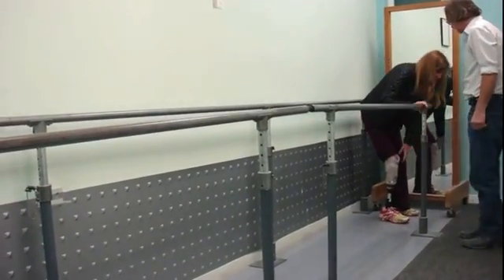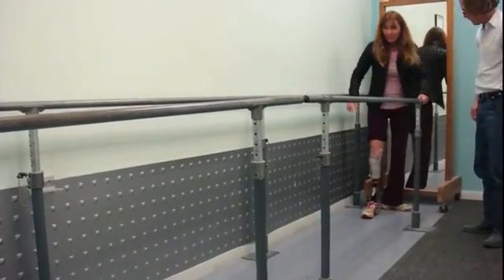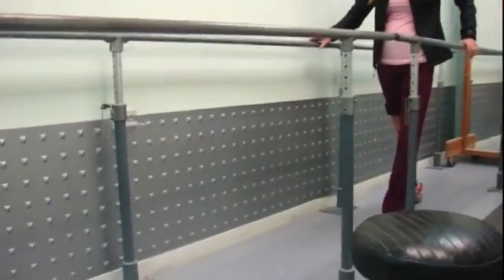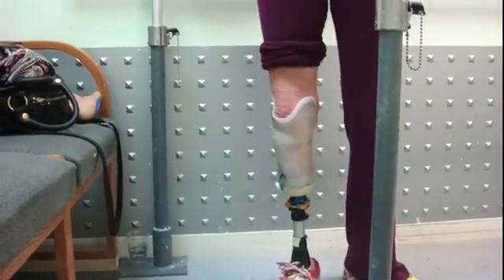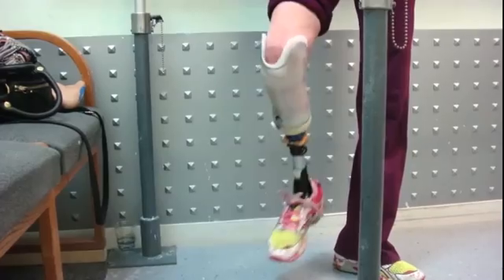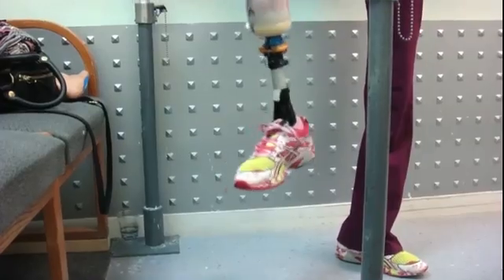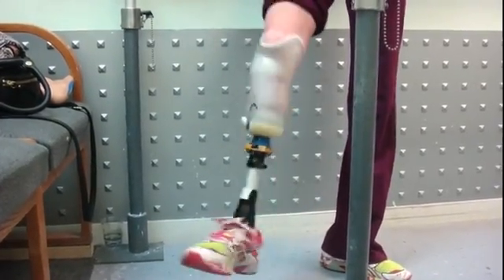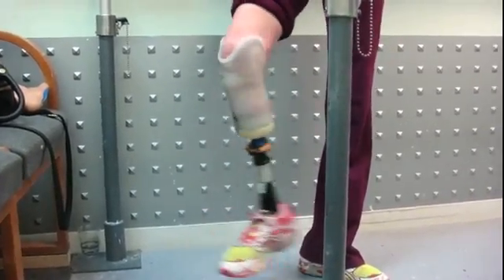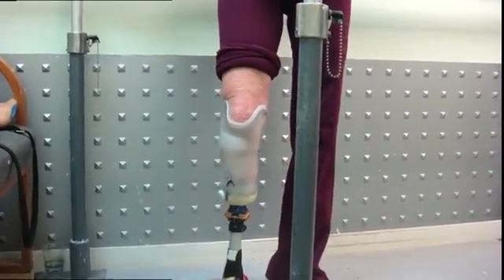Can we put the camera a little bit higher so he can get a good view of her walking without a sleeve? We've got to work on the alignment a little bit. Now check the suspension while she's right in front of the camera — bend it all the way into full flexion, pick it up like this. She can't bend any more than that — that's as far as it's going to go. That's a pretty positive suspension. It feels solid — that's from turning that thing the other way. That's awesome, good work.